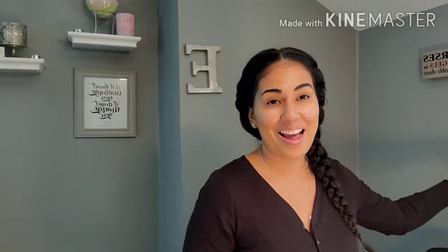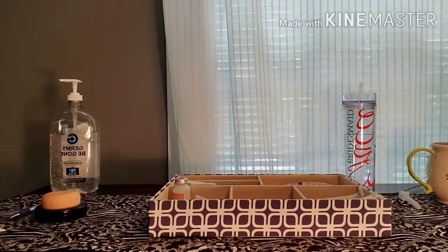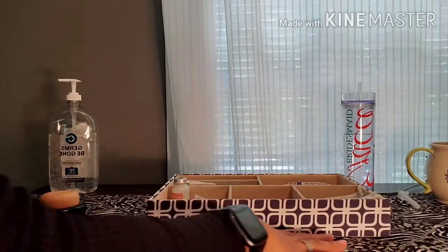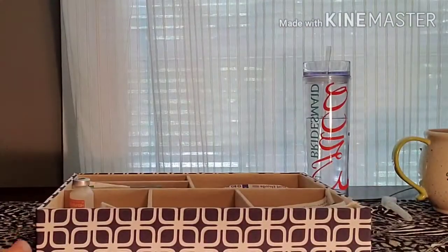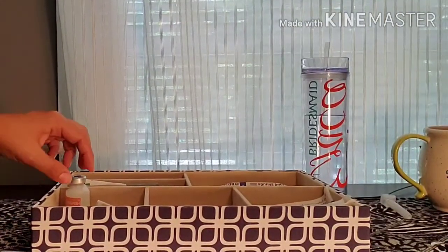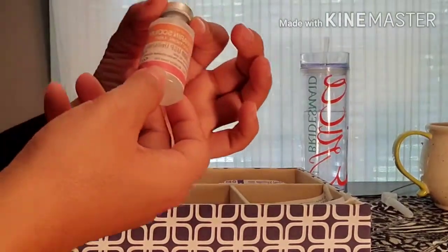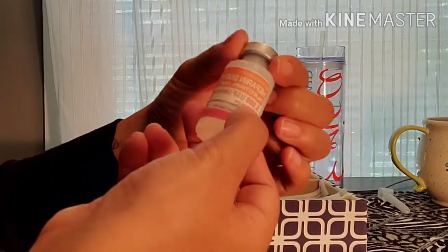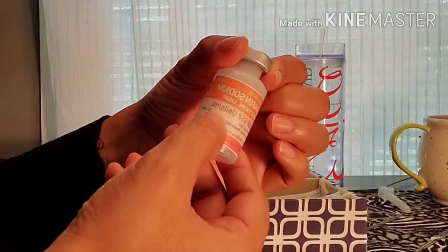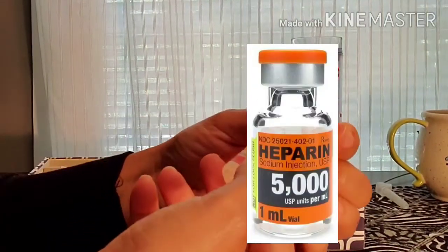First I'm going to perform my hand hygiene and go into my medication room to gather my supplies. I'm currently in my med room — I already performed my hand hygiene. I'm going to gather my supplies. Today I have heparin 5,000 units to give, and most commonly in the hospital the vials are 5,000 units per one milliliter.